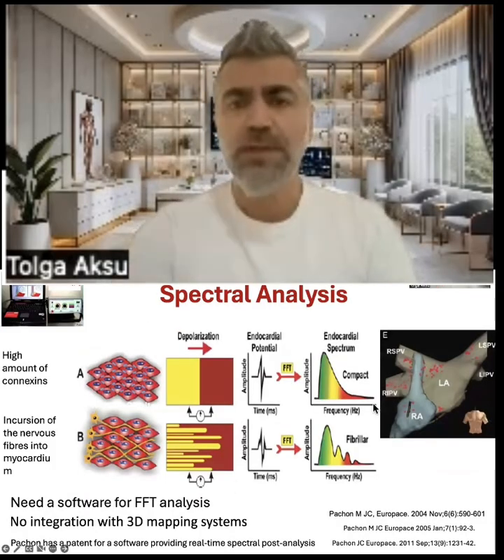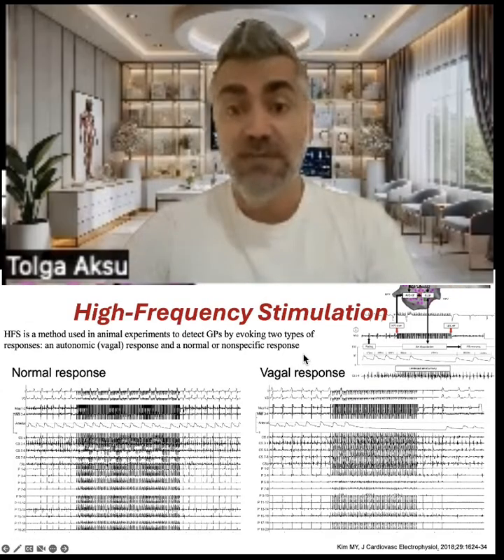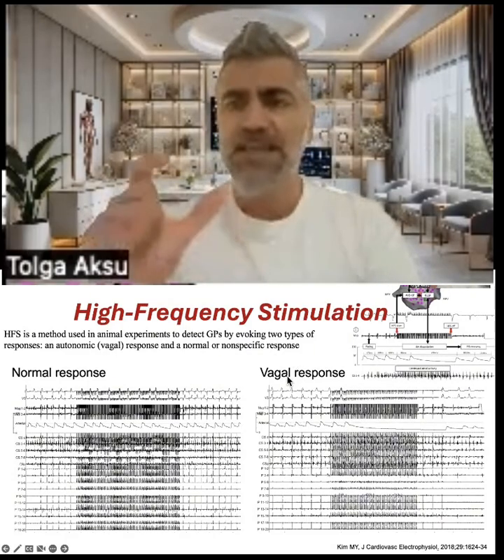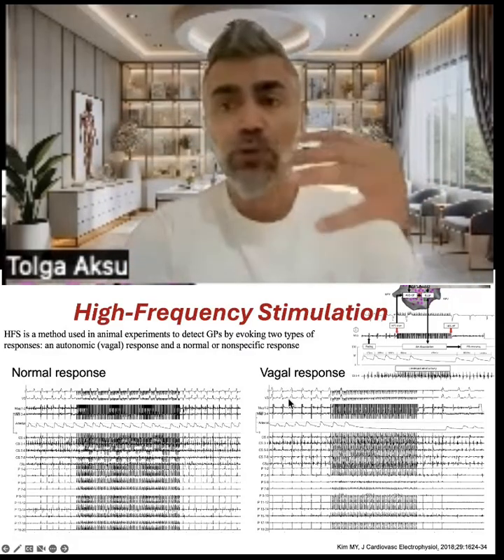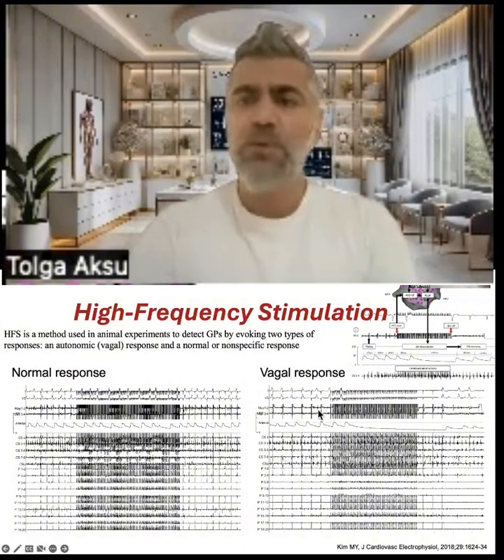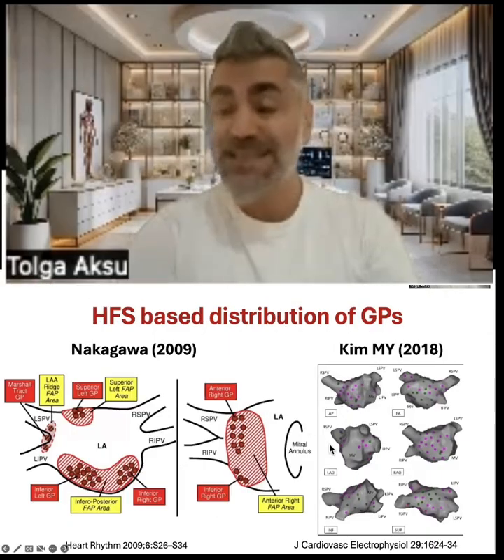Professor Pachon created the CNA and used spectral or fast Fourier transform analysis. I will not explain the details, but maybe we can briefly talk about high frequency stimulation. Basically, if you perform high amplitude and high frequency stimulation in the autonomic GP area, you should cause a vagal discharge. So you should see RR prolongation or PR prolongation due to the vagal effect. Different groups use very similar techniques.